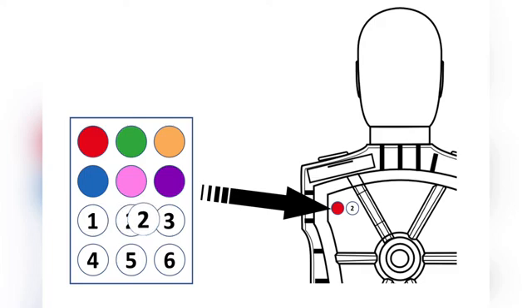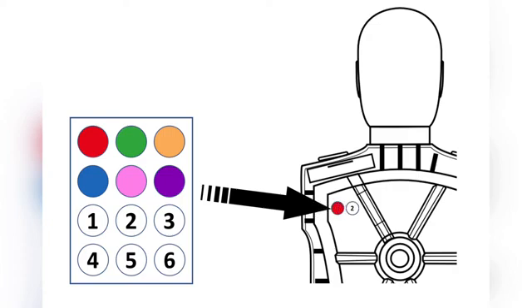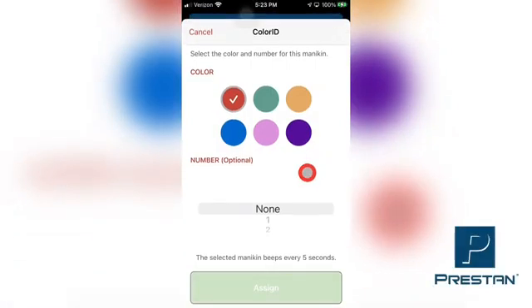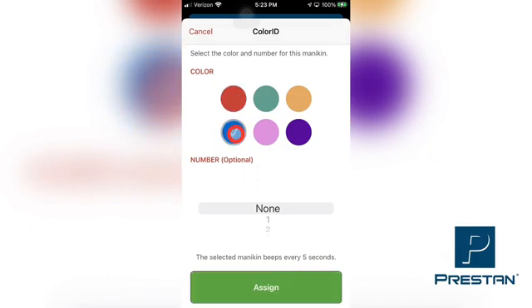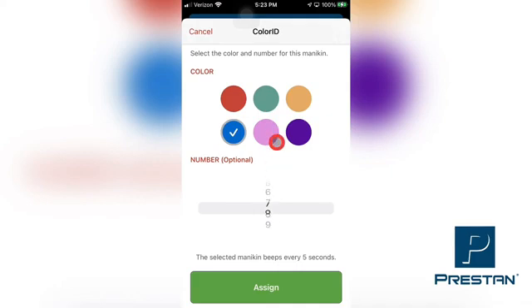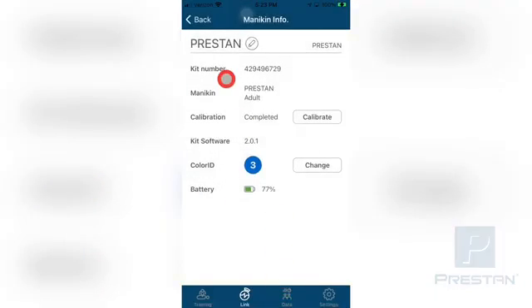Next, select the desired color and number labels from the color ID sheet provided with your device. It is recommended that you place the labels on the back surface of the mannequin, near the battery compartment. Affix the labels to the mannequin. Turning back to your smart device, select the corresponding color on the Preston CPR Feedback App by tapping on the appropriate color dot on the screen. Scroll through the number wheel to select the corresponding number assigned to the mannequin, then complete the process by selecting the Assign button at the bottom of the screen.